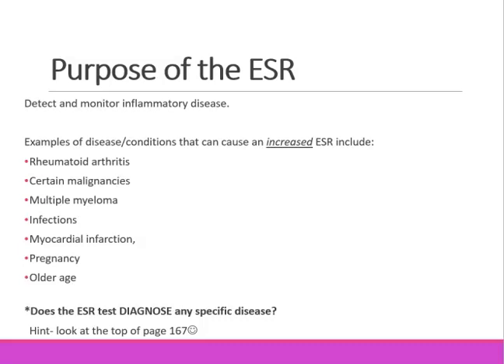So here's just a question. Does the ESR diagnose any specific disease? You can look in your book on page 167, but I'll go ahead and give you the answer. No, it does not. It is more of a screening for inflammation in the body. It's not going to diagnose particularly one of these conditions listed. It's just going to let us know that there is inflammation in the body somewhere.